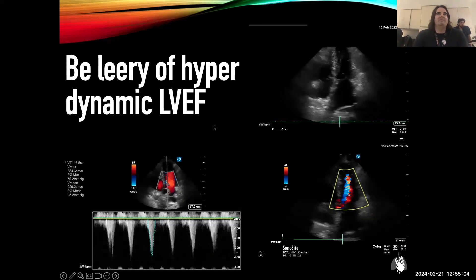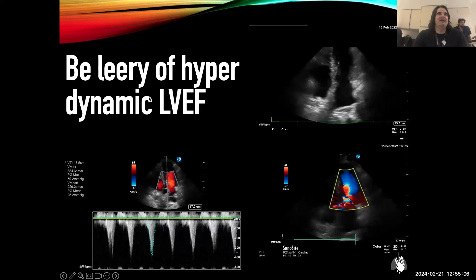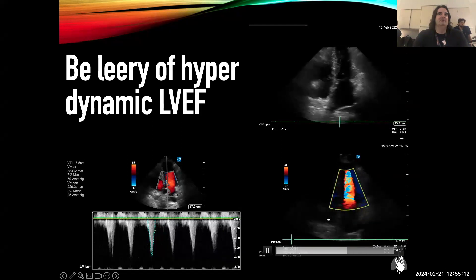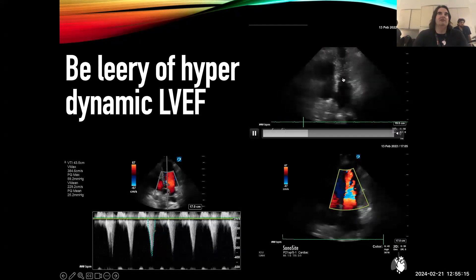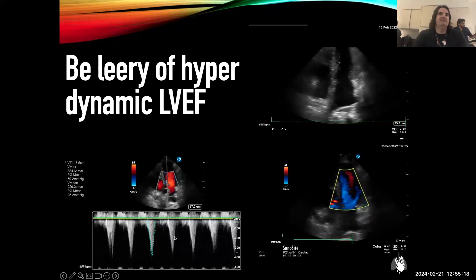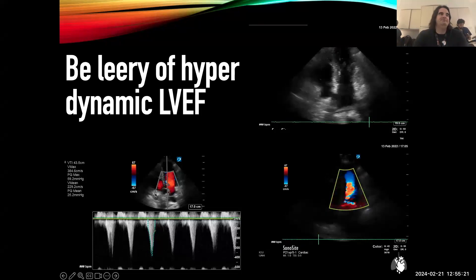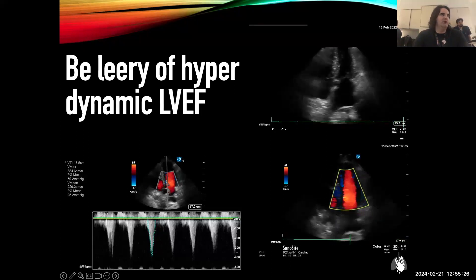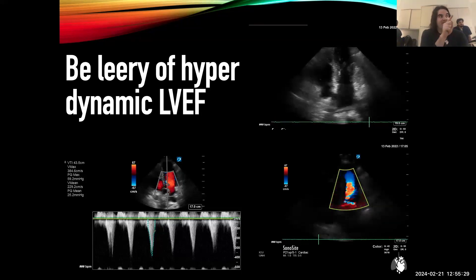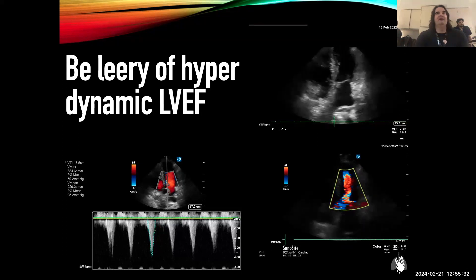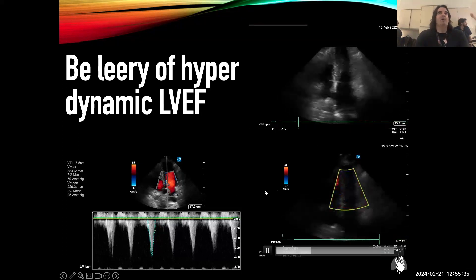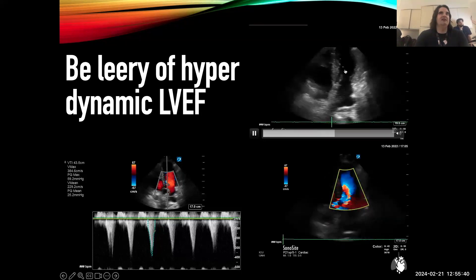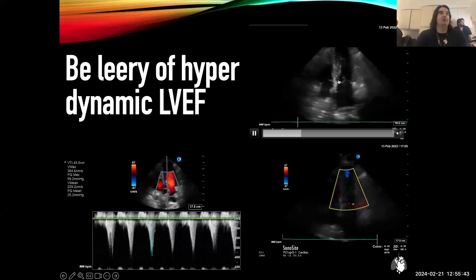Just be careful: people will see a hyperdynamic EF and think it's reassuring. But in this case, blood actually can't escape the ventricle because there's systolic anterior motion of the mitral valve — it's pulling into the LVOT. This shows how fast the blood is trying to escape. The rate of rise is actually exponential rather than linear because the obstruction gets worse as you go toward the end of systole — it's not fixed, it's getting smaller. So the velocity accelerates on acceleration. This is why a hyperdynamic ejection fraction can actually be very bad: it can indicate either a large cavitary gradient or obstruction in the outflow tract.